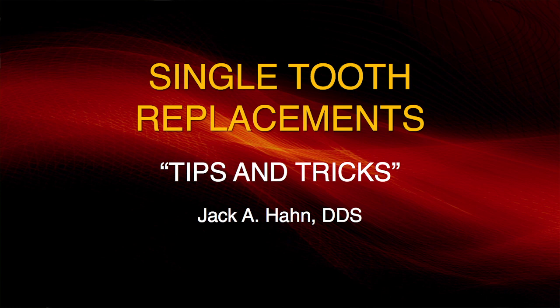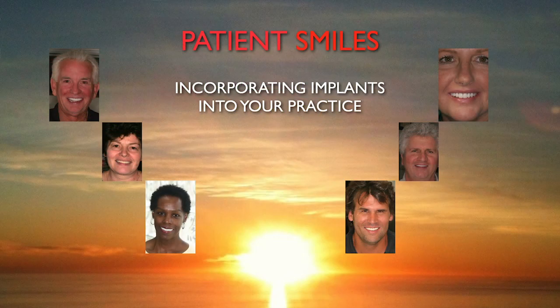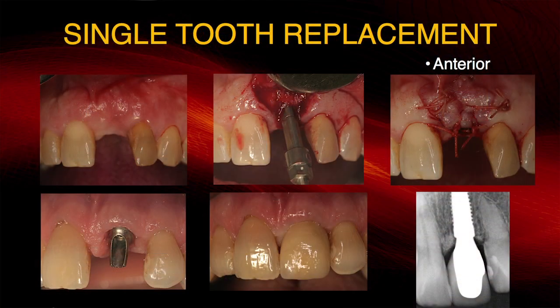So first we're going to start with flap design incisions in the anterior and the aesthetic zone. It's very important that in delivering implant dentistry to our patients, they expect the best and they expect optimum aesthetics. And every patient has a high smile line. You may think that they're not going to show the gum, but every patient, the minute you give them a mirror, that's what they're going to do. They're going to raise their lip and you're going to see the gum. So how do we preserve this? Another idea is we can help prevent doing connective tissue grafts if we design our flaps properly.